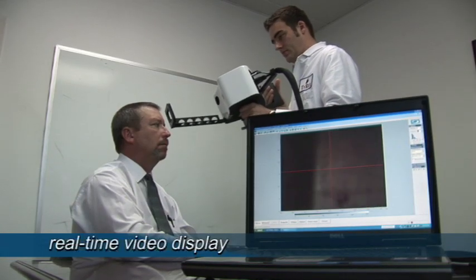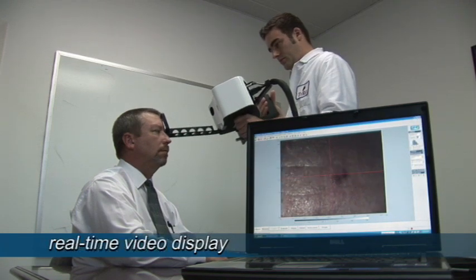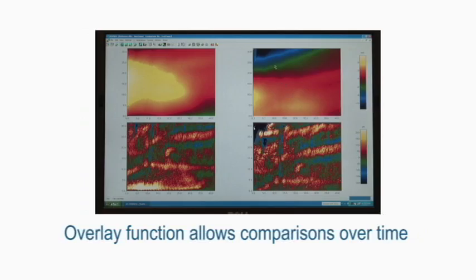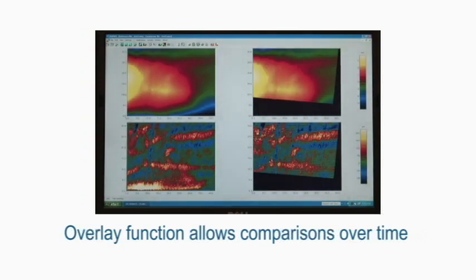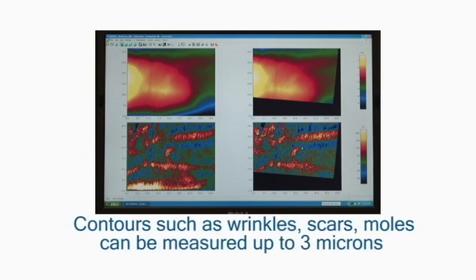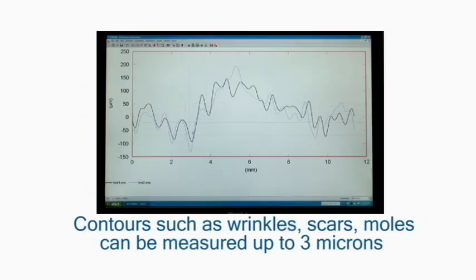The patented software provides real-time video display for analysis. The overlay function allows direct comparison of images taken over time. Using graphic measurement and color texture representation, changes can be quantified and measured. Contours such as wrinkles, scars, moles, and other abnormalities can be measured with accuracy up to 3 microns. These images can be used to verify progress or changes over time as a result of treatment or procedure performed on a patient.